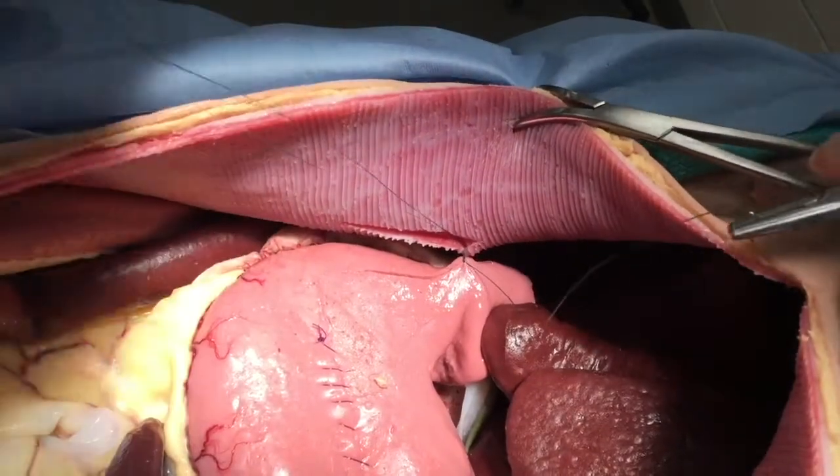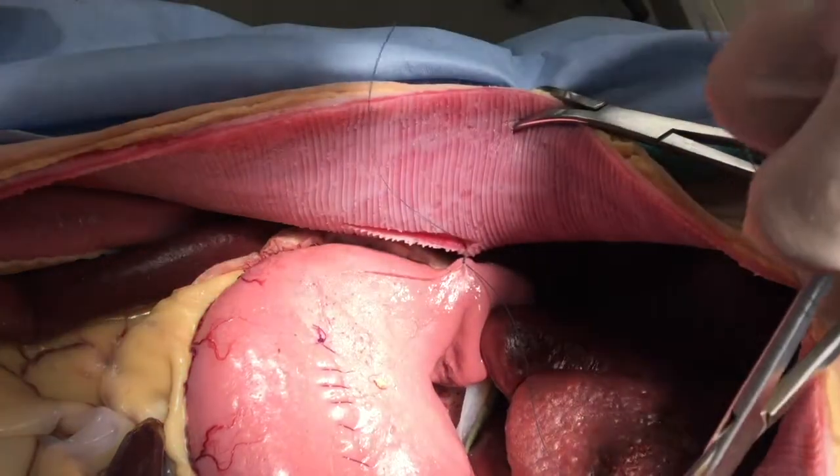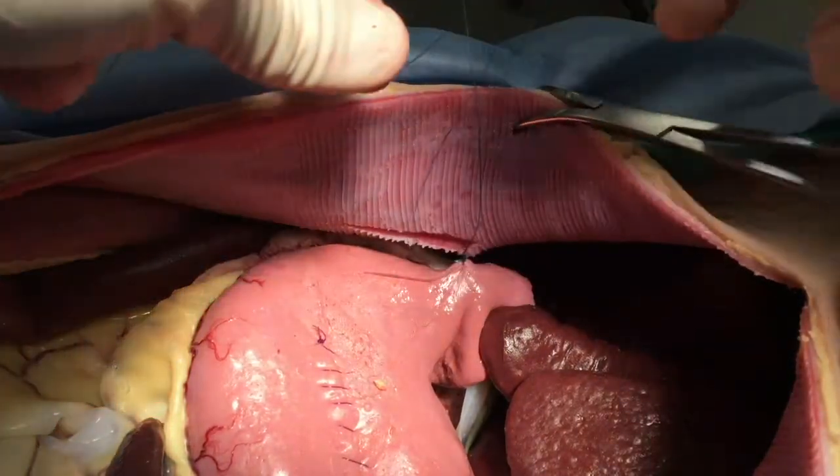You can see that once that first suture is tied, the stomach should be well opposed to the body wall. This should not be a crushing suture, just an appositional amount of tension.